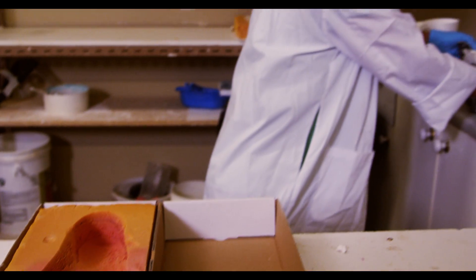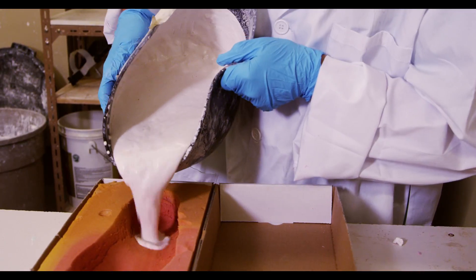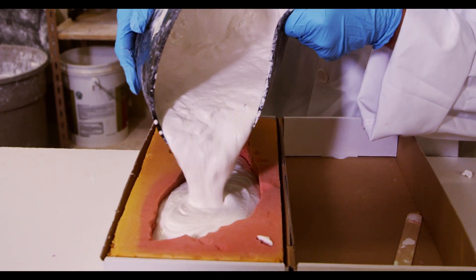The digital process does not work for certain foot types — for example, very small or large feet or certain amputations. For these cases, we use a traditional plaster process.